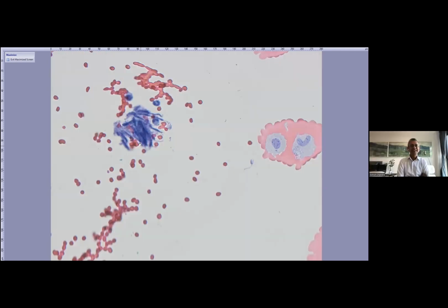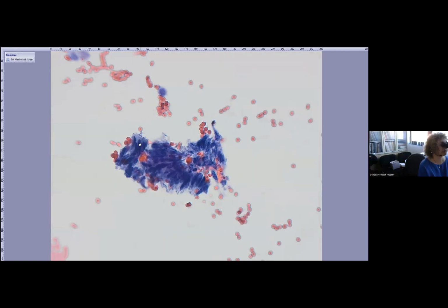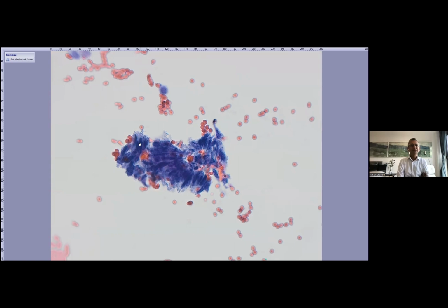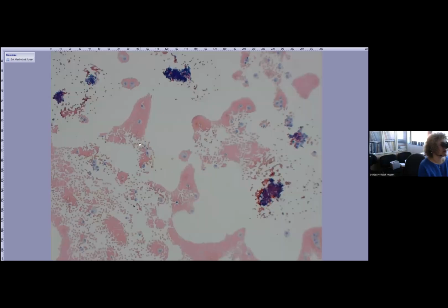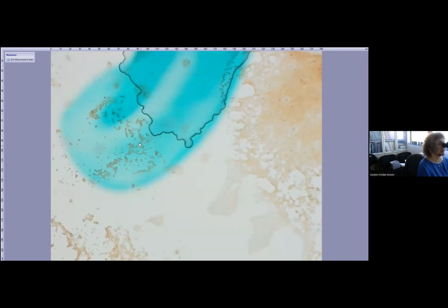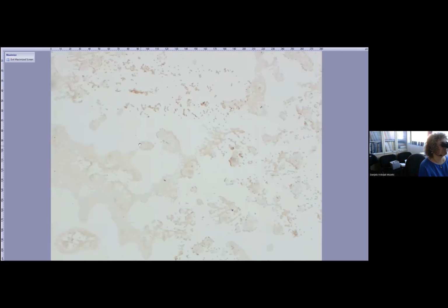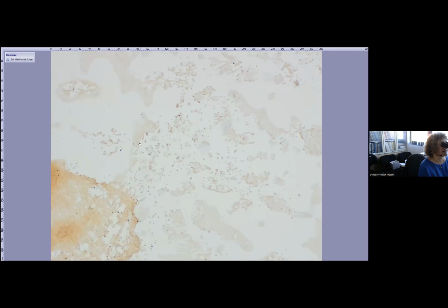But you can observe something really, and here some kind of elongated cells. So I was a little bit worried what all these cells are, with different features. So we really did immuno on the cytological samples. So this is PAX8. And this is really pale, but everything was negative.